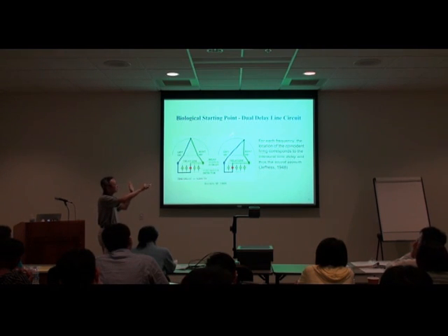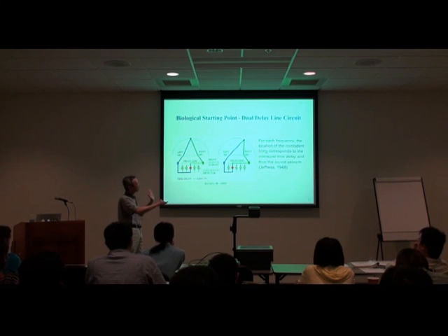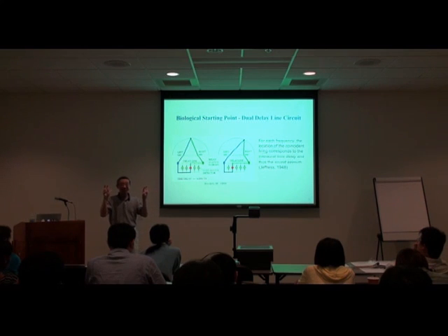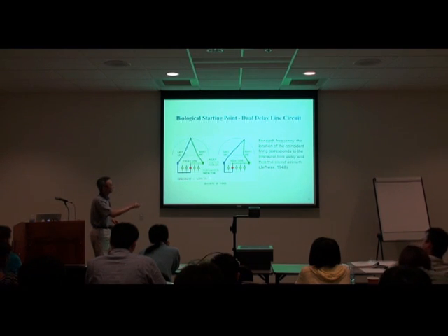So if you move this further and further away to the right, the coincidence is going to take place further and further to the left and the way down. On the other hand, if the signal now deviates from midline to the left-hand side, the coincidence will take place further and further to the right. You get it? So what you have here is a translation of the space into delay, and then back, and this is a one-to-one map of the time delay, or the location of the coincidence, that tells you the actual location of the source.